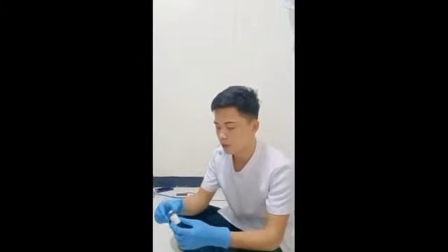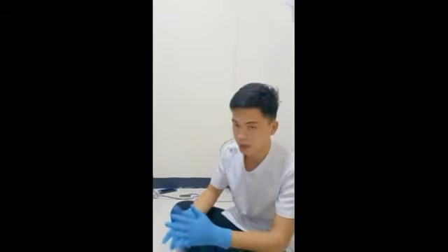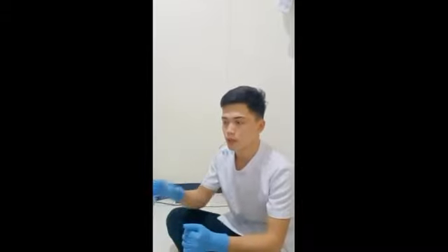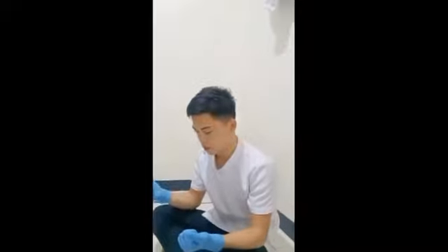And for example, this is the vaccine or the antibacterial medicine. This skin test procedure is to verify allergies for my patient and to know if he has an allergy to the medication when we insert it in this skin test. So this is reflected in the skin test injection. Okay.